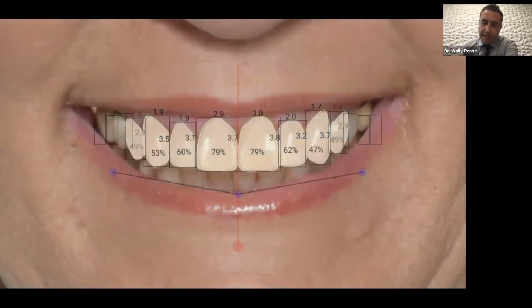And you might say, well, those don't look ultra realistic. And I like that they don't look ultra realistic, because there's some smile design softwares that literally take somebody else's mouth and put it in another person's mouth. And it's so pretty, but I could never achieve that final aesthetic. So I like that this is almost just a smidge cartoony, because it's supposed to be just a simulation. And I actually like that.